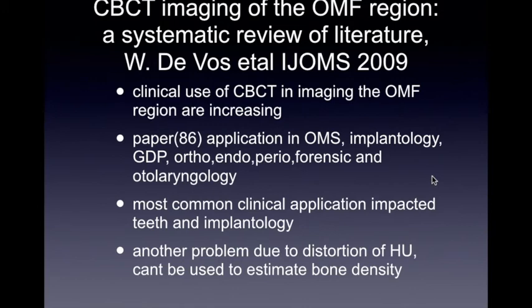One of the problems that is perennial to CBCTs up till now is the distortions in the Hounsfield unit, and therefore estimations for bone density, and density per se, for this three-dimensional image is still far from what medical CT scans can do. And thus, that is where there is still the need for medical CT scans. There is an indication for CBCTs.